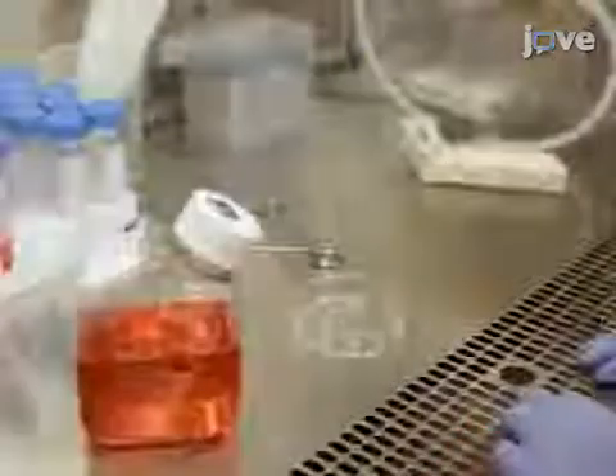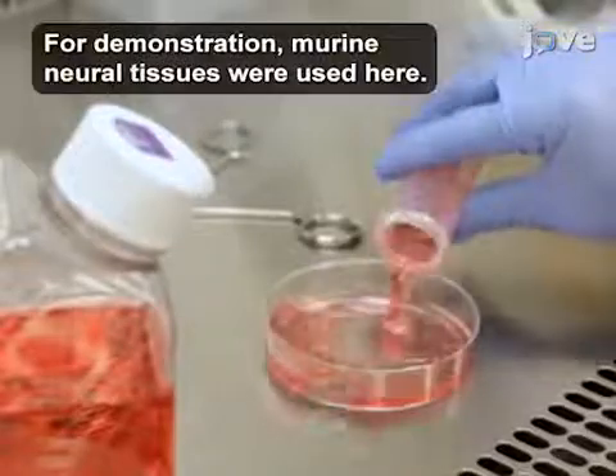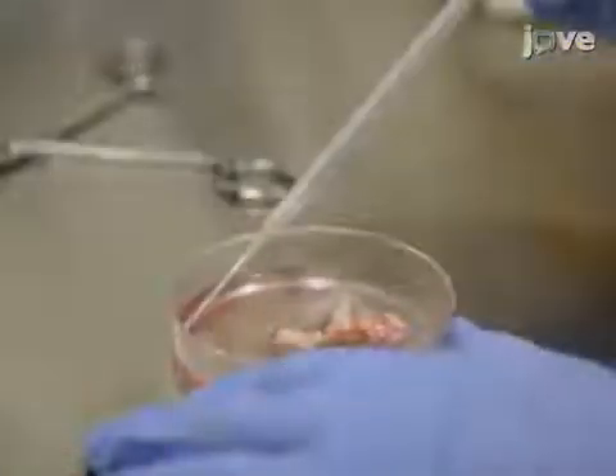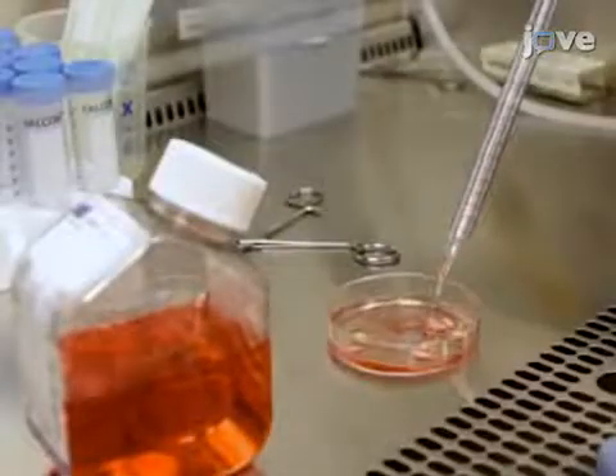Next, transfer the tissue into a high-walled 100 mm x 20 mm cell culture dish. Remove the media leftover from shipping and replace it with 10-15 ml of cold culture media.